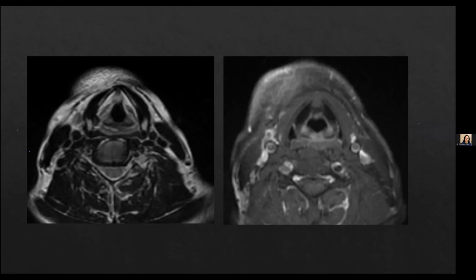Dr. Kajari, how and when to use MRI as a troubleshooter? So MRI, as I told, is basically used for mainly two things. We should be very fast in imaging these patients because they are already in the gantry. It's first an uncomfortable situation. It's a longer examination procedure, and if there are breathing-related artifacts, then it doesn't serve our purpose. So we should use it in a very targeted manner.